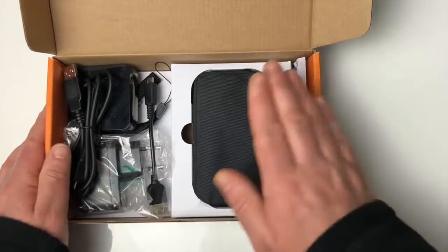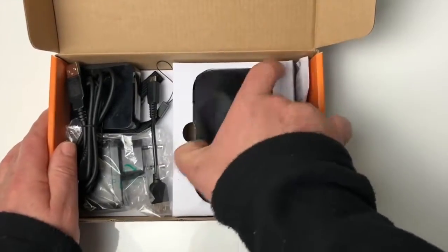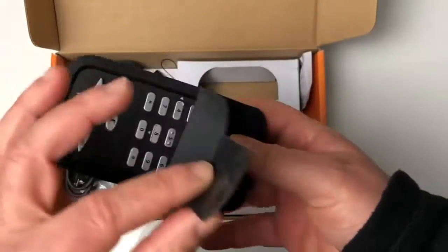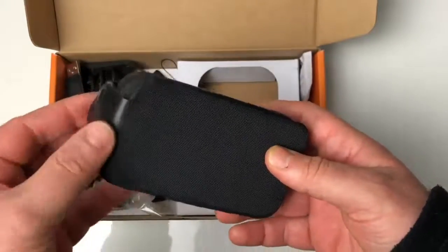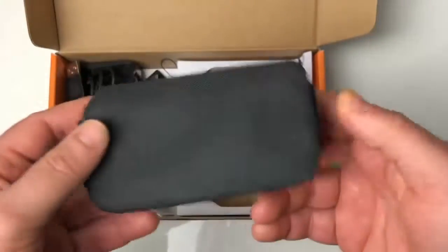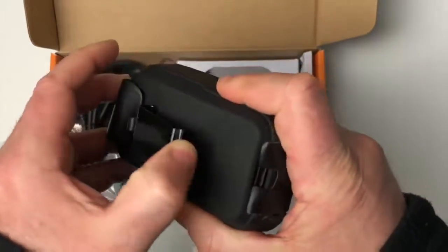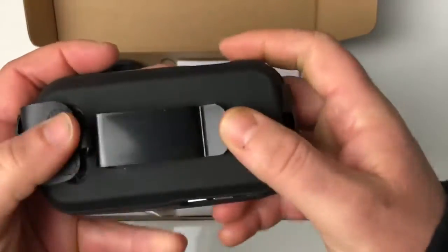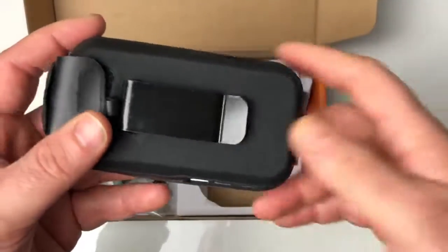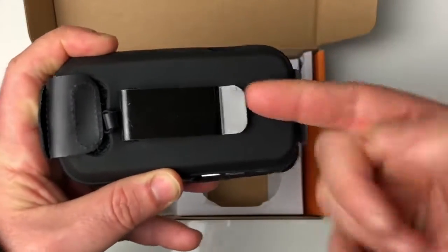La boîte face à nous, l'appareil se trouve à droite. Il est placé dans une housse en tissu avec un clapet aimanté — on l'entend clairement. Derrière cette housse, on a une grosse pince pour mettre l'appareil à la ceinture ou à un sac en bandoulière. L'appareil sera donc très bien fixé grâce à cette pince.